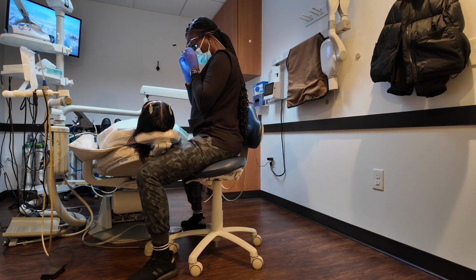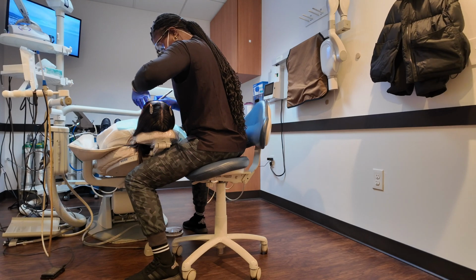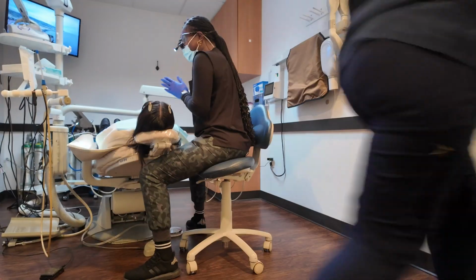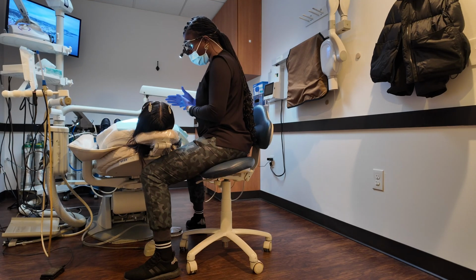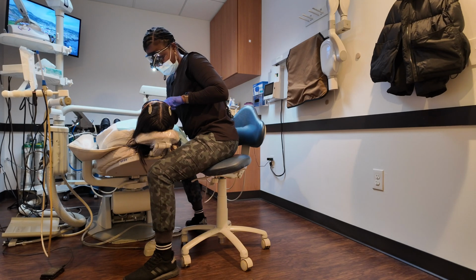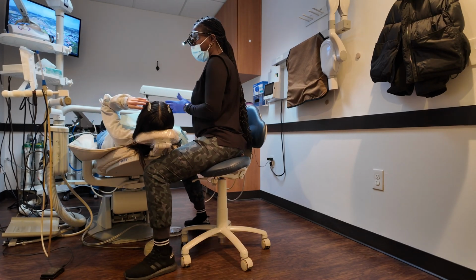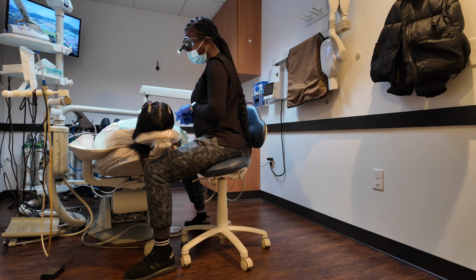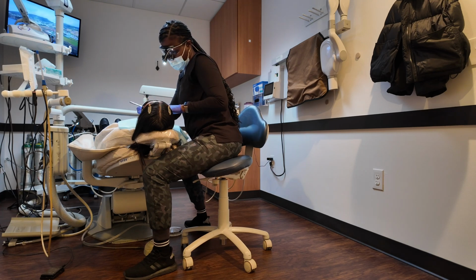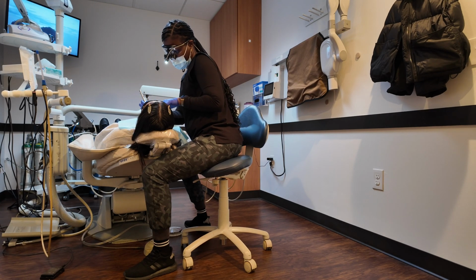First thing that you're going to see me do is just look inside of their mouth, checking to see how everything's looking. We're looking at soft tissue, we're looking at hard tissue, we're looking at the teeth themselves, and just getting an idea of how their hygiene is, and if we see any sort of lesions or anything that is notable, we'll make sure that we jot that down. In this moment, there was something that was irritating my patient, and so we were just discussing what it is that I recommend to do for that irritation, trying to figure out how it happened, and we'll go from there.